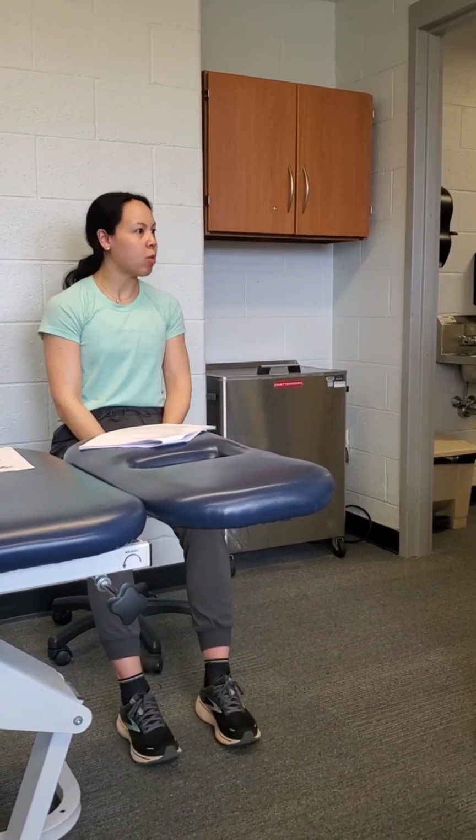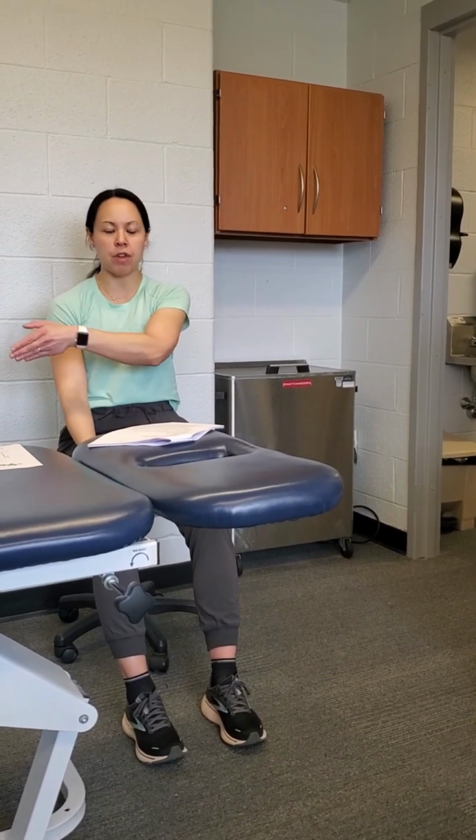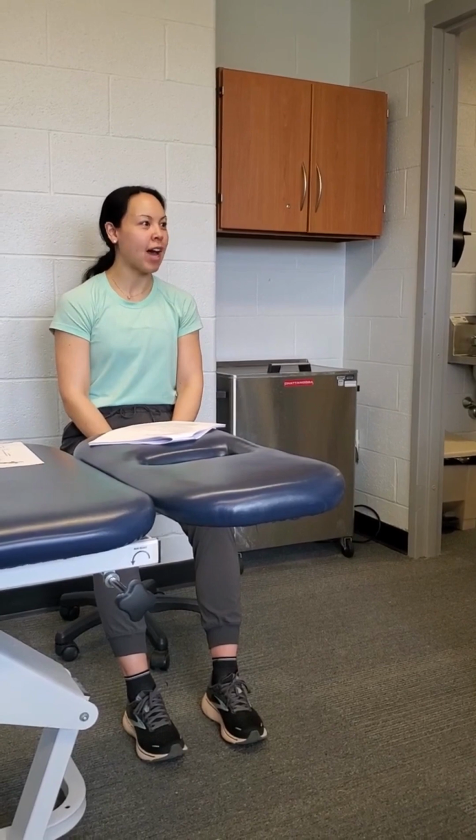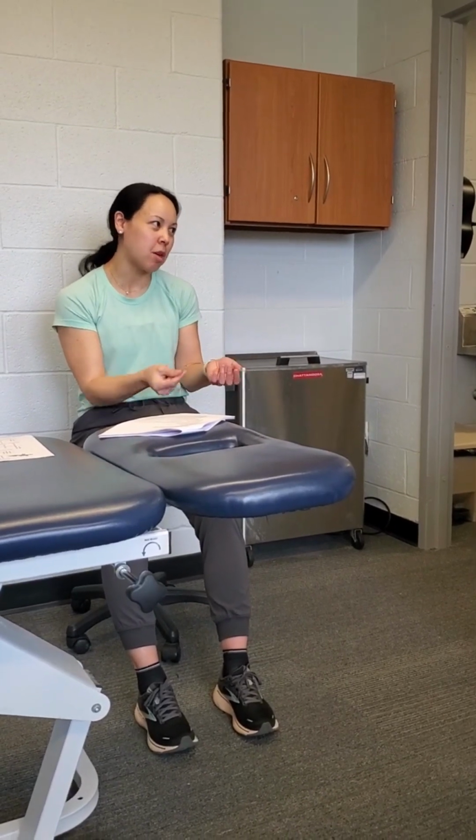You've used it before too. What do you think? Anecdotally, you won't have to use much resistance at all, especially in those first sets. Honestly, during the seminar we were just guessing. Even the students were asking. The instructor was literally like, pick up a 2-pound weight and try that. Go through your 30, 15, 15, 15, and if you make it to 75, go to a 3 or 4 pound weight. And if they're struggling, say in the second set, that's probably going to be the quickest way.